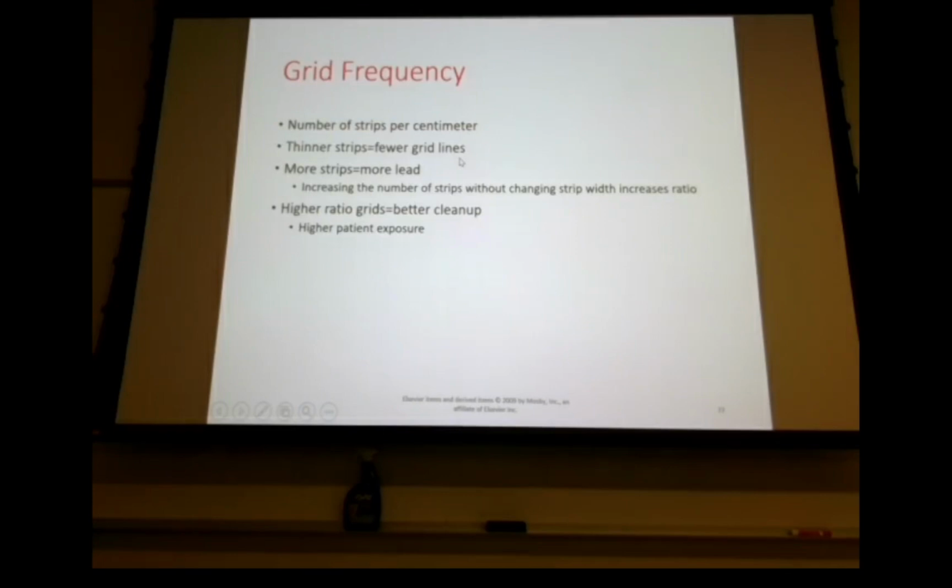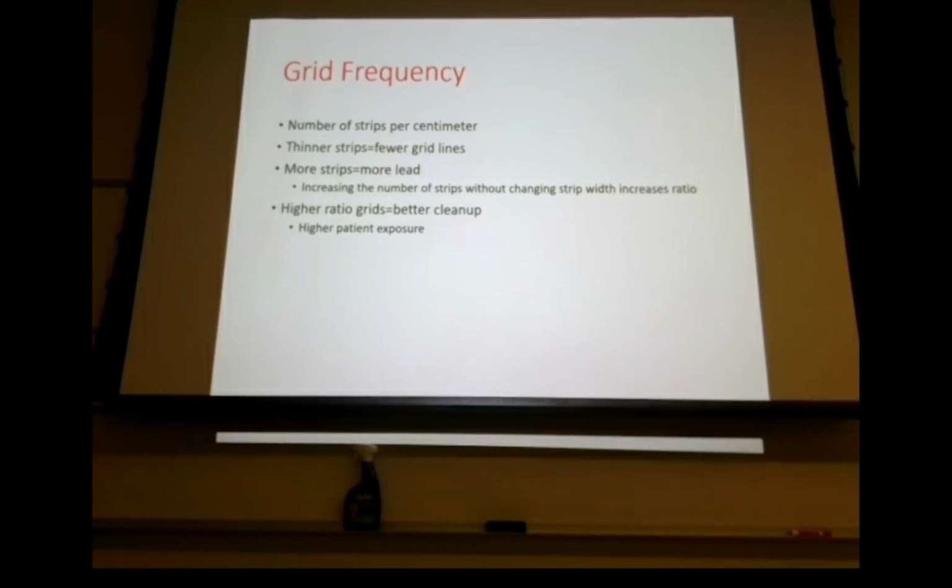So grid frequency then is less complicated, and that's just how often you're gonna have a lead strip. Okay, so I'm gonna pull this one up and we're gonna do just a little bit of math.